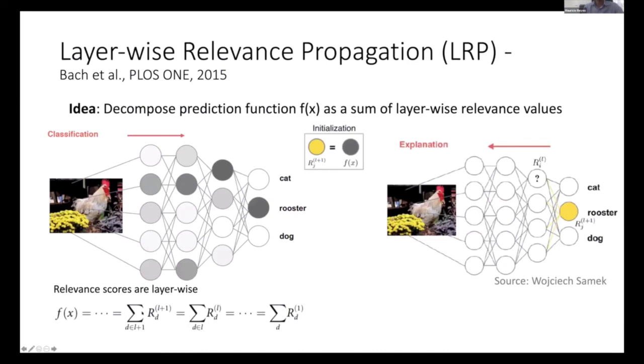So here you see the different layers, and I'm going to compute relevance scores that are per layer. And I'm going to normalize them because I want to have similar contributions per layer. By doing this operation, you have a more robust approach than, for example, Grad-CAM, as I showed you before.